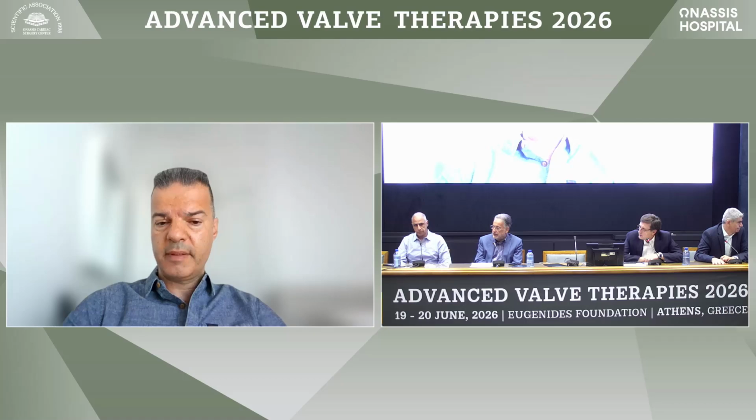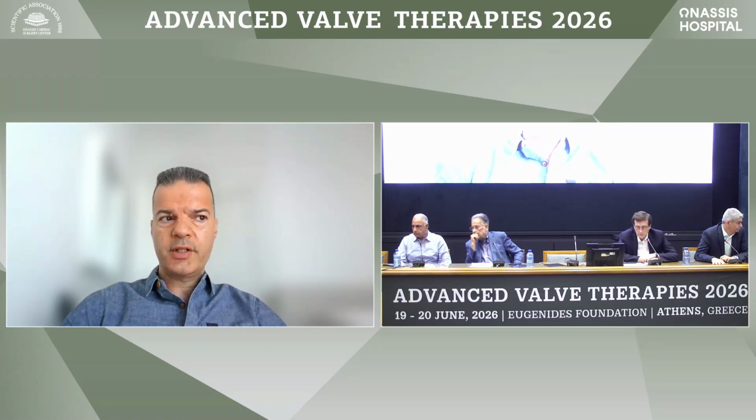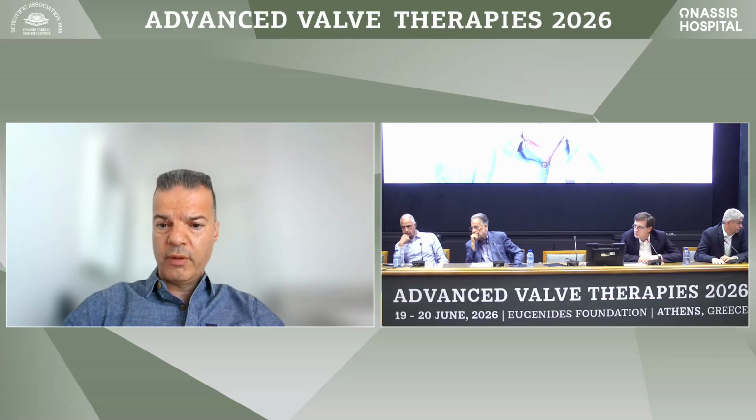I just showed the Pascal device, but do the same with the TriClip. And I share all the concerns and the difficulties with Moni regarding the posteroseptal region. Imaging is more challenging, more cords there. However, if you can do that, you should do that, because really it's a more balanced and symmetrical way of repairing the valve. Your indirect annuloplasty effect is also more symmetrical.